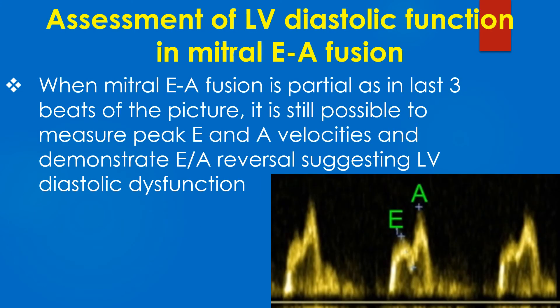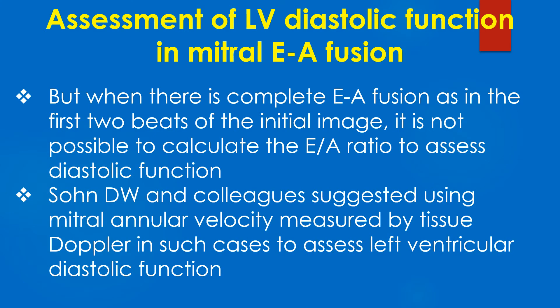When the mitral E/A fusion is partial, as in the last 3 beats of the picture, it is still possible to measure peak E and A velocities and demonstrate E-by-A reversal, suggesting left ventricular diastolic dysfunction. But when there is complete E/A fusion, as in the first 2 beats of the initial image, it is not possible to calculate the E/A ratio to assess diastolic function.